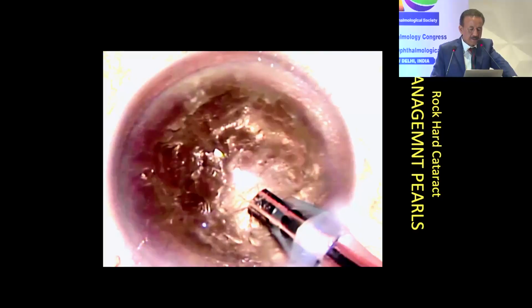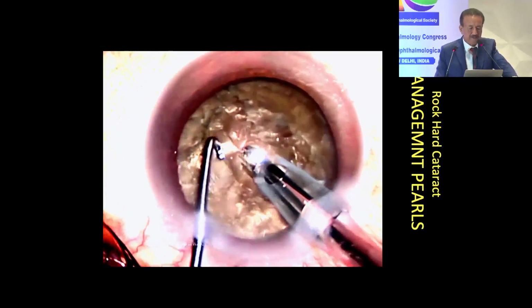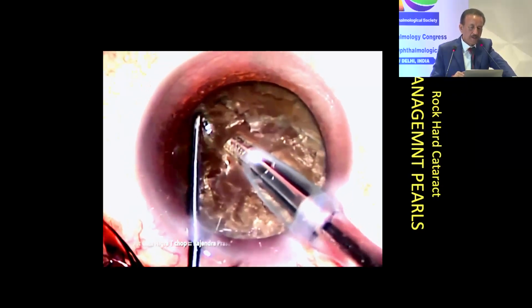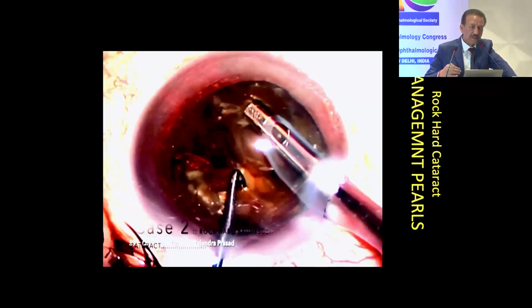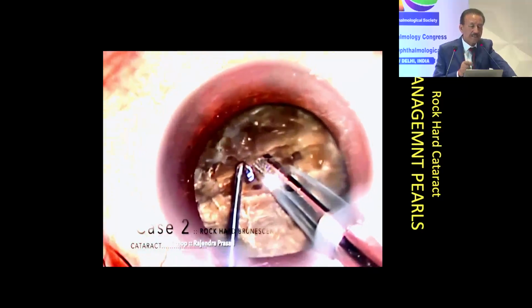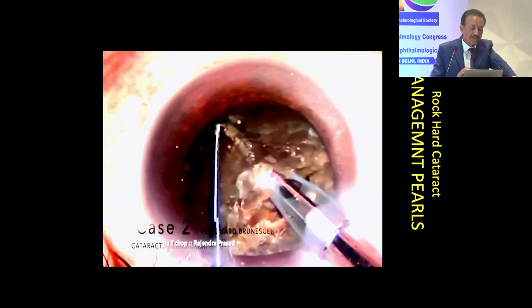And this is another case. You can see this is a grade 6, grade 7 nucleus, which is an absolutely hard cataract, which we call nigra. Otherwise, normally it becomes very difficult to cut, chop, or do anything with this cataract. Even making a trench becomes very difficult. But as you can see, with this cracker, you can crack this kind of nucleus also. You just held it and you have split the nucleus into two.